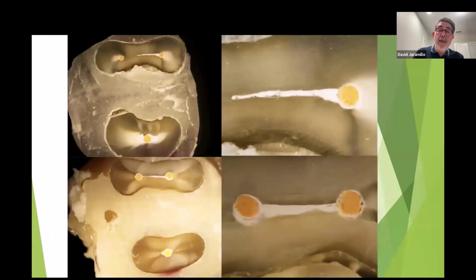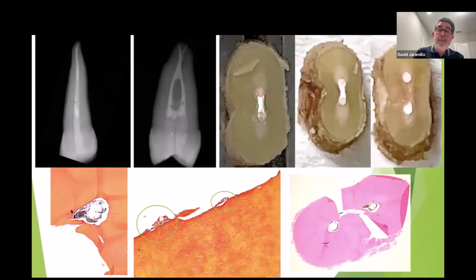These are GentleWave. And some cases that have been treated with GentleWave but have failed. Well, the reason why this one failed is because the tooth was cracked since the beginning. So the dentist talked to the patient, and he said, well, we have this new technology. We're gonna give it a try and see if we can save the tooth.